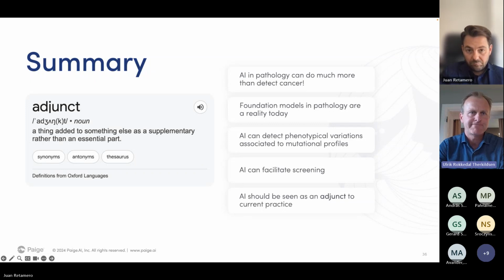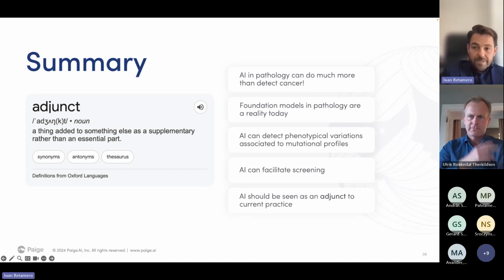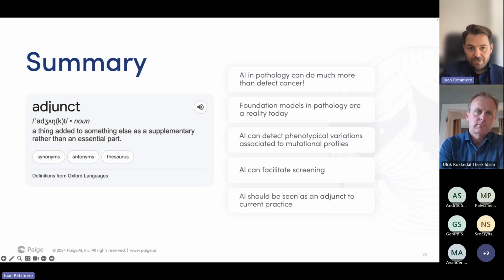What's your reflection here? So yeah, bear in mind that the paradigm that we follow was using the AI as a binary detector. So I think in principle that would be consistent with the evidence that we have so far. So in other words, a subgroup of patients do not have sufficient mRNA to render them in principle responsive to the new therapeutic agents, whereas another subgroup of these patients would be. So I think in principle, this binary classification would start to make sense.